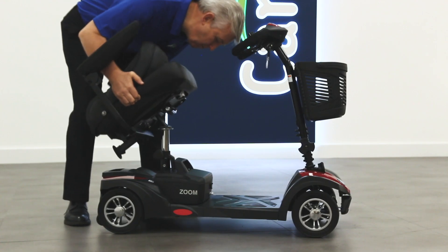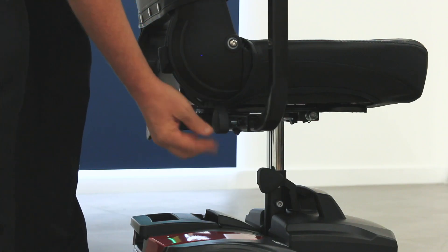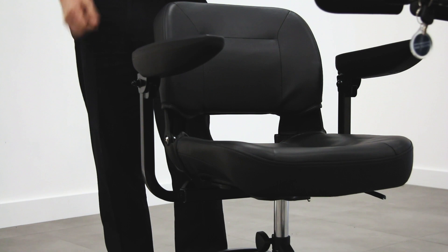Guide the prong on the bottom of the seat back onto the seat post. To adjust the width of the armrests, just loosen the screw at the rear of the seat and slide the armrest to the correct position before tightening the screw.